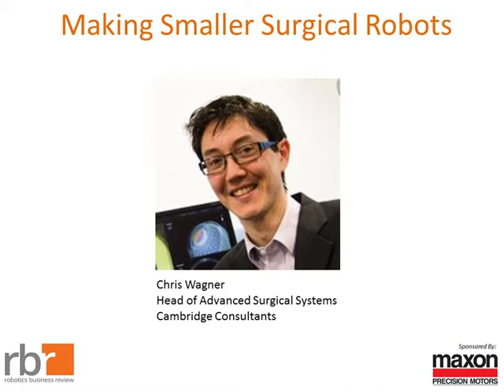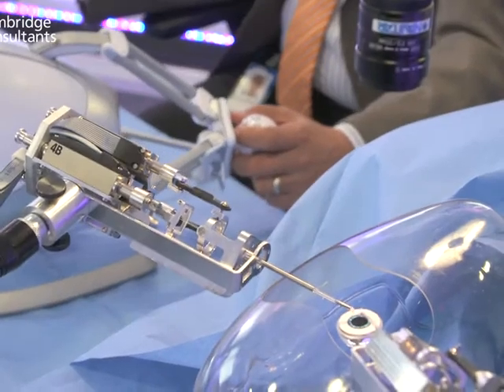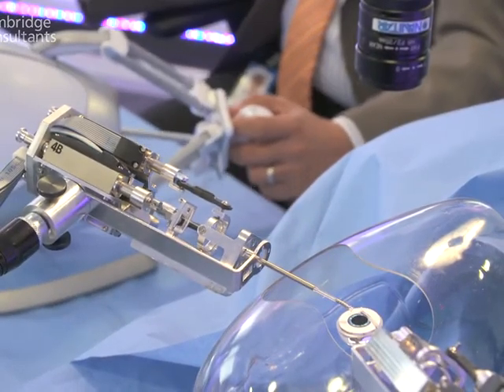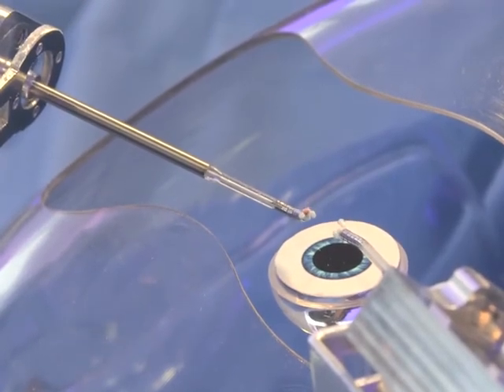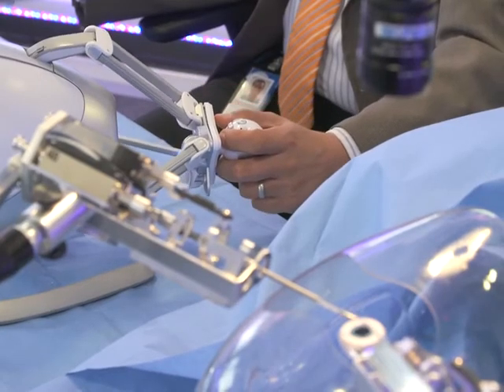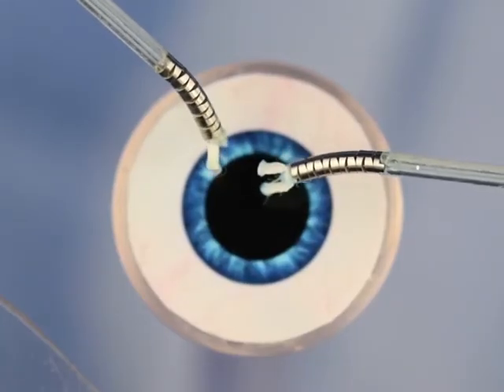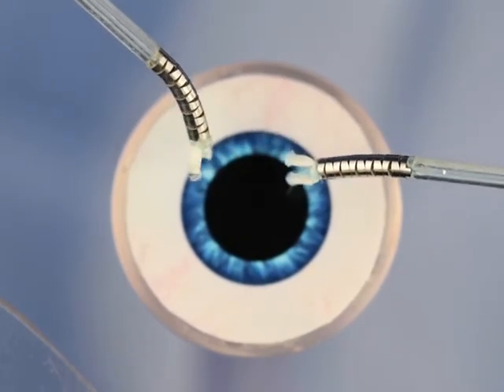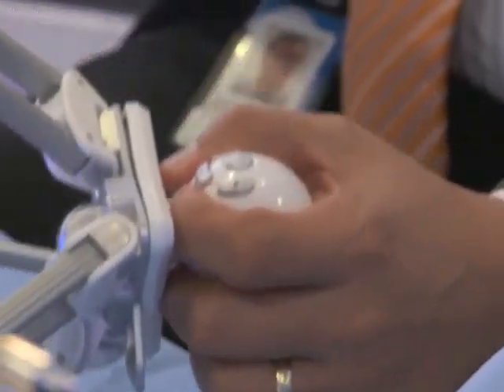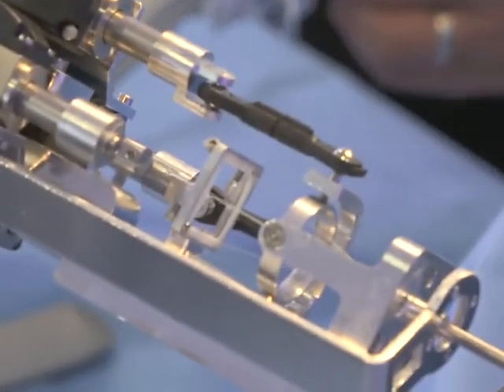Now, again, Axis isn't being sold as a commercial product. It's simply a prototype that shows what next-gen surgical robots could look like and what they could do. Axis uses flexible instruments instead of straight ones, and it also has novel motor and control configurations that help reduce the overall size of the robot and also make it safer by eliminating the need for a large range of motion outside the body. So, Chris, thanks again for joining us. What are some of the compromises that were made to enable Axis to be so small? Is Axis just as accurate and safe as larger surgical robots?